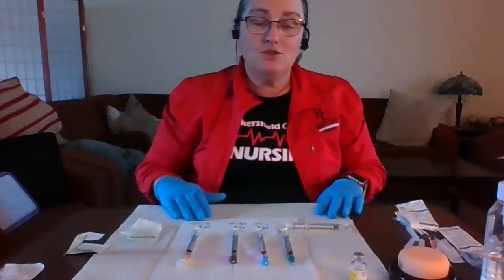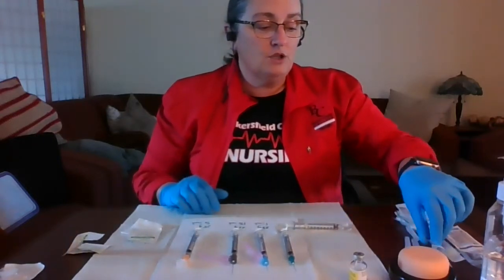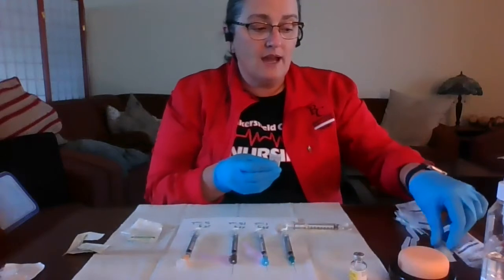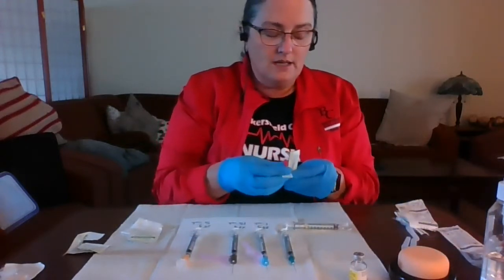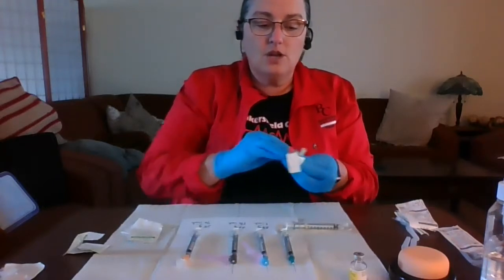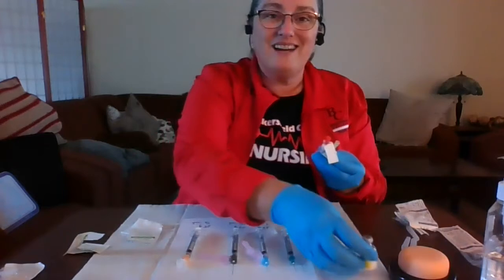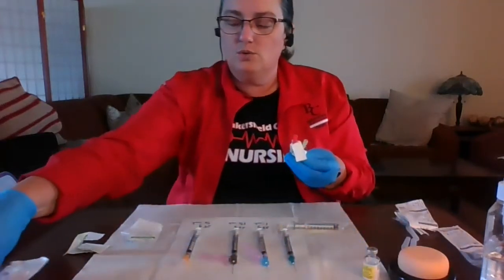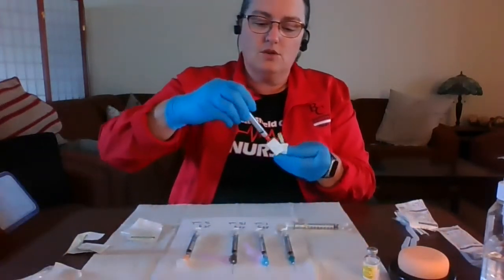You're then going to need your syringes and your needles. You may have the opportunity to have what we call a draw syringe and draw needle, and this is where these needles are meant just to pierce the vial and draw the medication out. They are not ever meant to be used for actual administration, and I'll show you why.